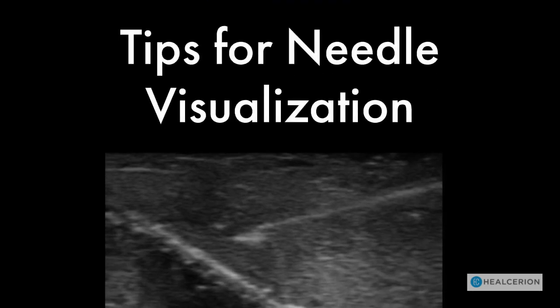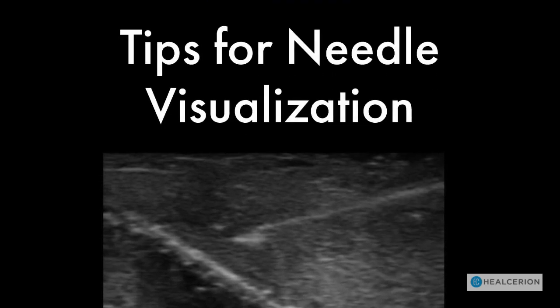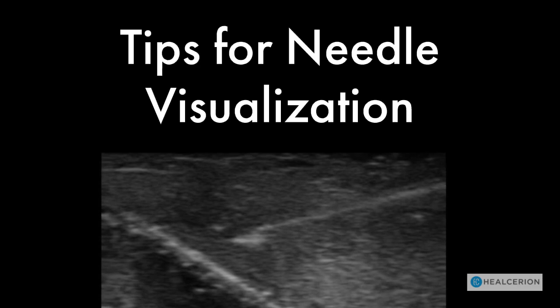This video will provide some tips for optimizing visualization of the needle with ultrasound.